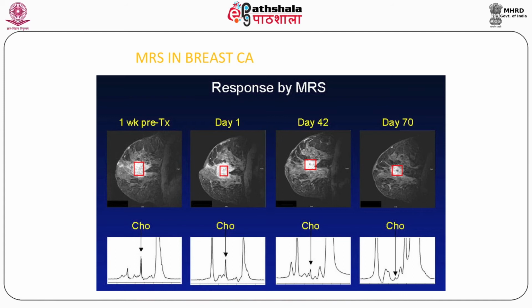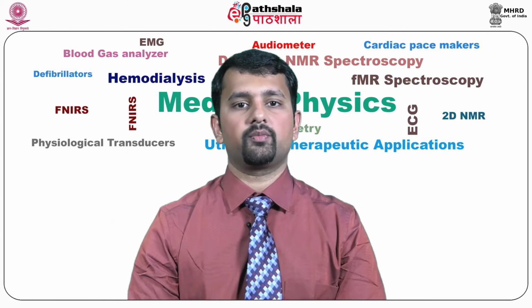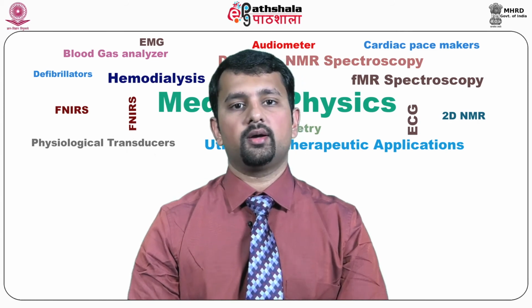Repeat, help us analyze the biochemical changes when specifically charted over time. Now, let us look at the application in liver imaging. Firstly, evaluation of diffuse liver disease.